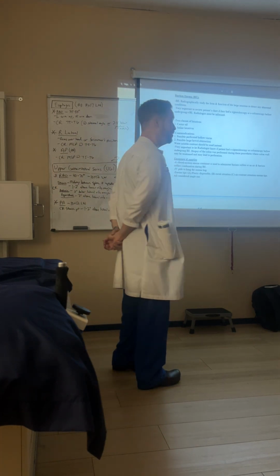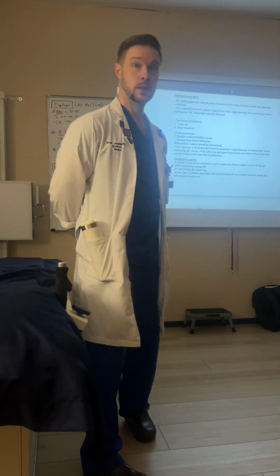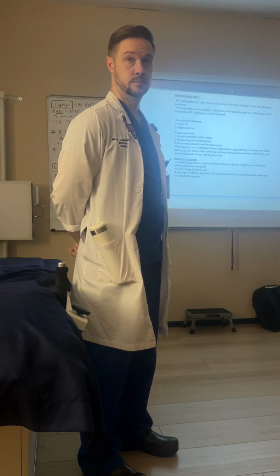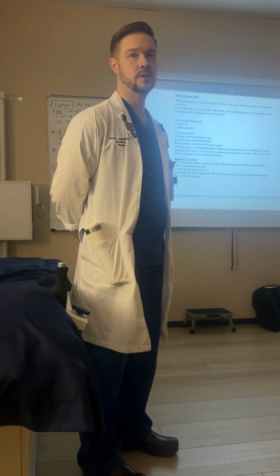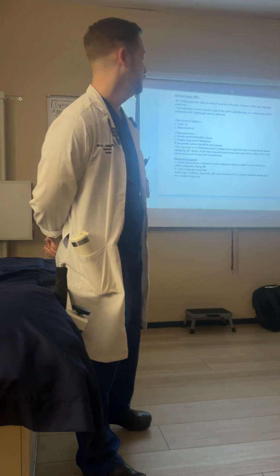All right, questions on any of that? Oh, I remember now. When you said you can use single contrast or double contrast, that would also be directed from the doctor, right? Yeah. He would tell you. It would be whatever the history of the patient is going to be the indication.